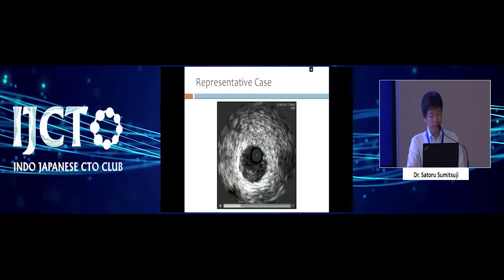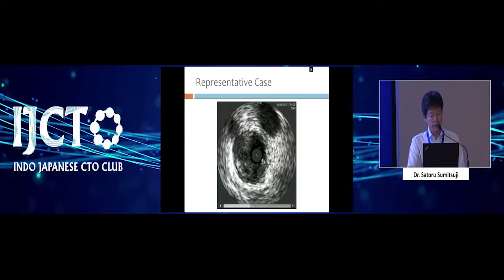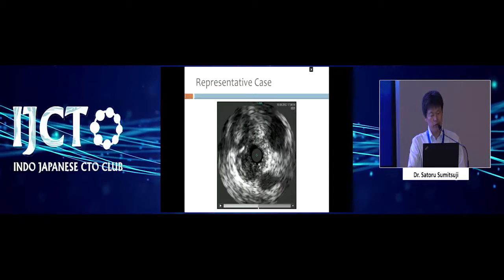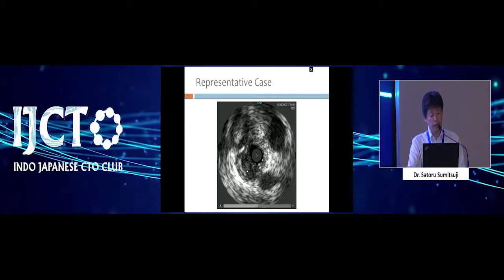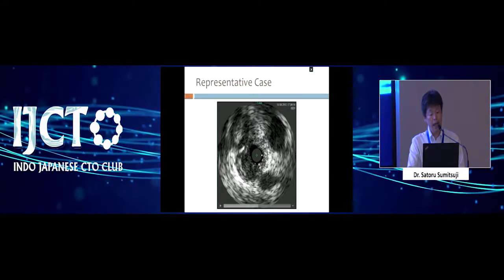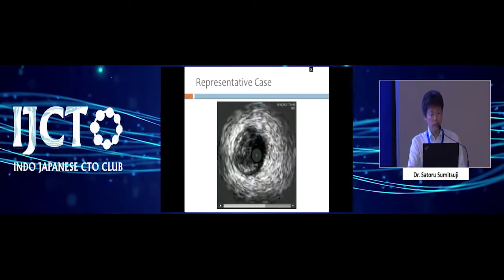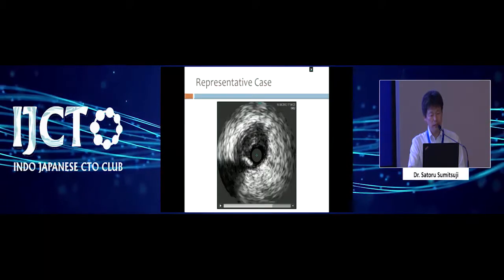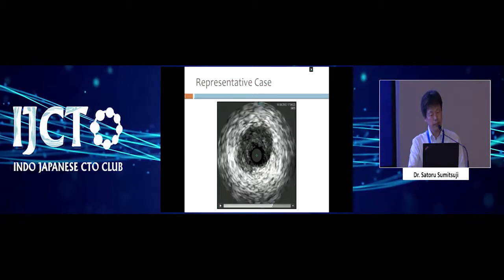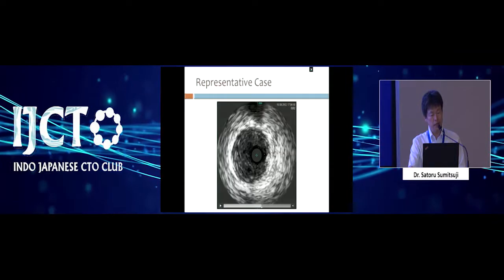And then, pulling back, a branch comes into this intimal plug zone, and this branch also comes in here, and then these two branches are also connected to this intimal plug side. Not this one, because this is, of course, false lumen and subintima. And where is the point where the wire advanced into the subintima space? It is probably from this septal. Just from this septal, the wire advanced into the subintima.